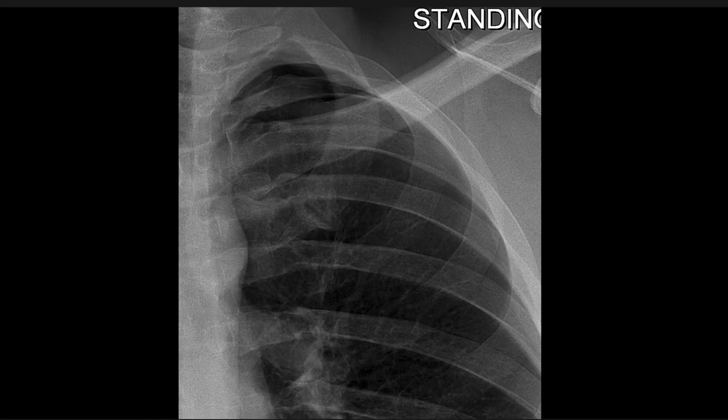If we saw one or two there, we wouldn't say there's no pneumothorax, especially given the fact that pretest probability is excellent. He just had a line placed on this side. We've got a pleural line here. It's following the contour of the chest, and we feel pretty confident calling this one positive. Let's take a look at another case.